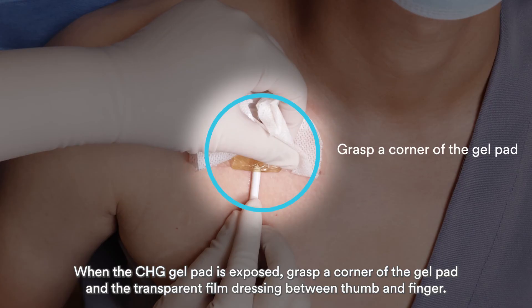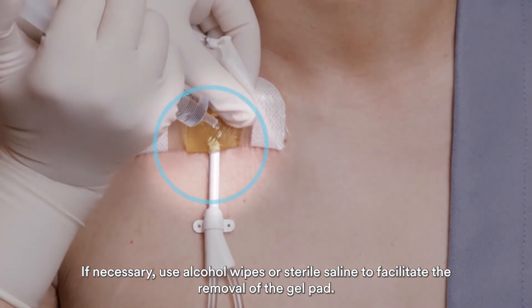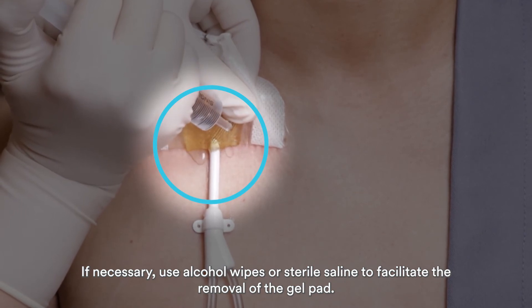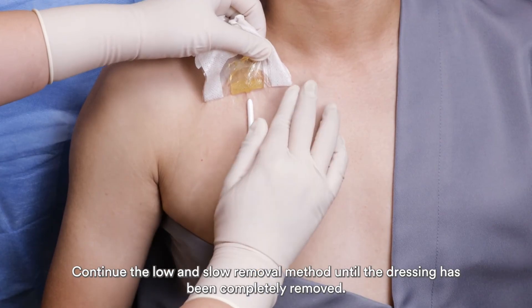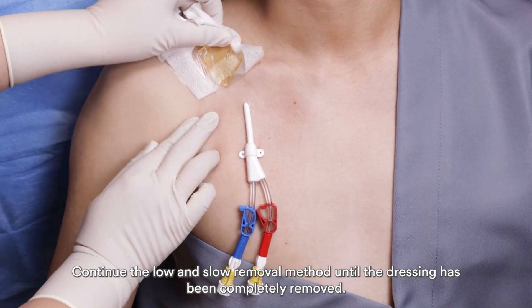When the CHG gel pad is exposed, grasp a corner of the gel pad and the transparent film dressing between thumb and finger. If necessary, use alcohol wipes or sterile saline to facilitate the removal of the gel pad. Continue the low and slow removal method until the dressing has been completely removed.